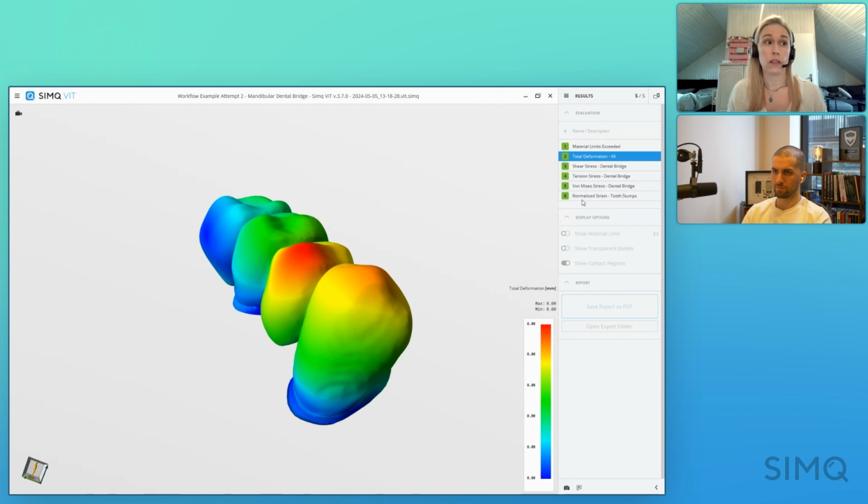So if you're trying to find a prototype or a place to start your clinical study, maybe you have a couple of prototypes, but as you know, it's expensive. So if you need some types of testing that way, we offer virtual benchtop testing. If you're interested in co-development of other anatomical regions, dental specifically, we're coming along with that. So that should be up and running out of a beta version soon. I'm interested in hip, knee, shoulder, things like that.